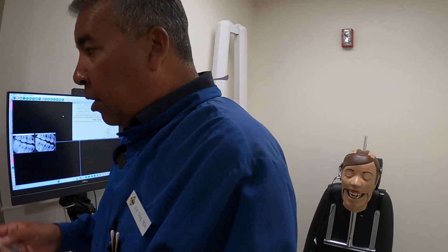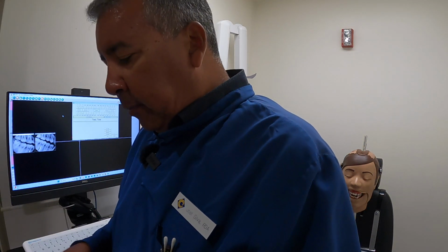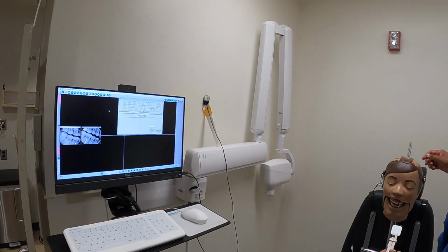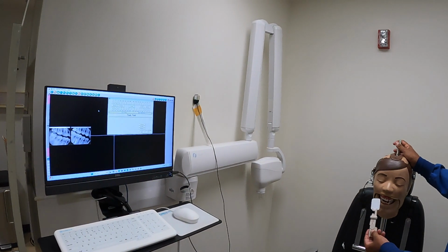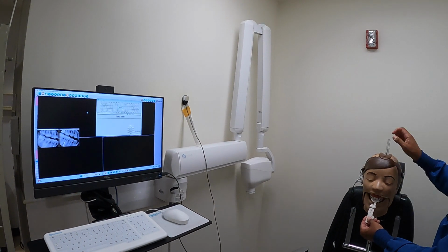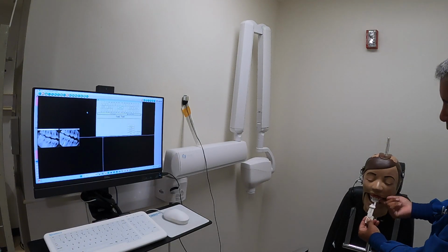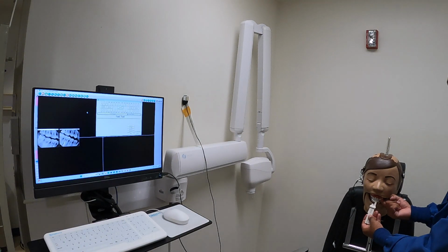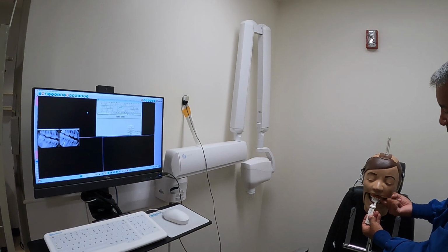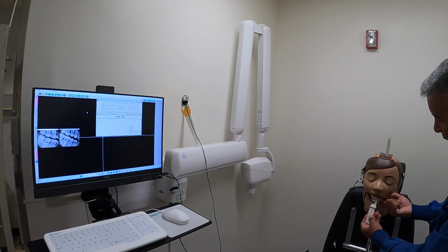Last week, I'm going to go back to film. I know this is digital, but without this, digital is a little bit tougher. So we really want to refresh our memories. When we take our anterior and place it in the patient's mouth, remember that we're going to use those forks and go to the patient's incisal edge. I want to make sure that the film or sensor is up against the palate, and I want to keep it at that angle. I don't want to flatten this thing out. I really want to keep it at the angle of that palate.